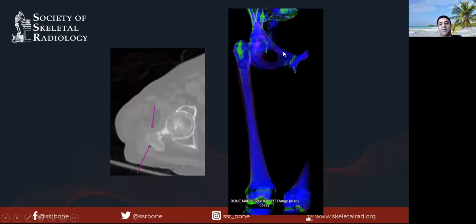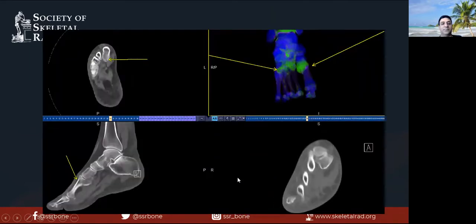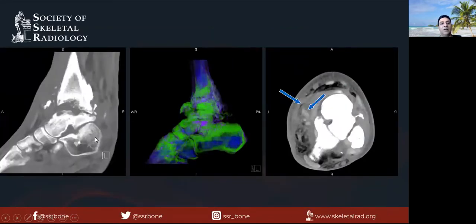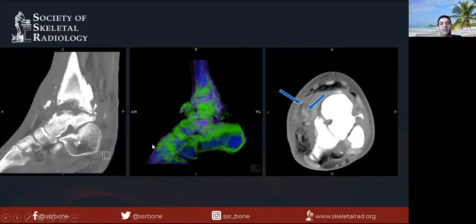Ignore artifacts at the edges since you'll get some artifact there. For smaller bones like the carpus and tarsus, non-displaced fractures are harder to pick out, especially when imaging from the pelvis all the way to the toes. This midfoot fracture was missed on call, but you can see edema right in the midfoot — just like bone contusion on MR, these small bones all show edema with the most edema at the fracture site. You can also see other pathologies, such as this Charcot ankle with a lot of bone destruction, debris, effusion, and bone edema throughout.